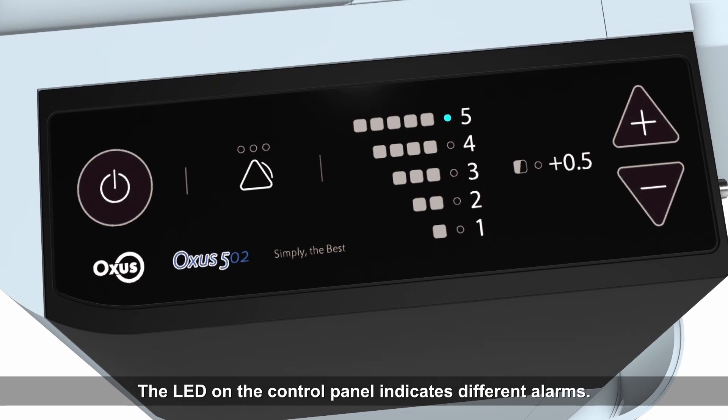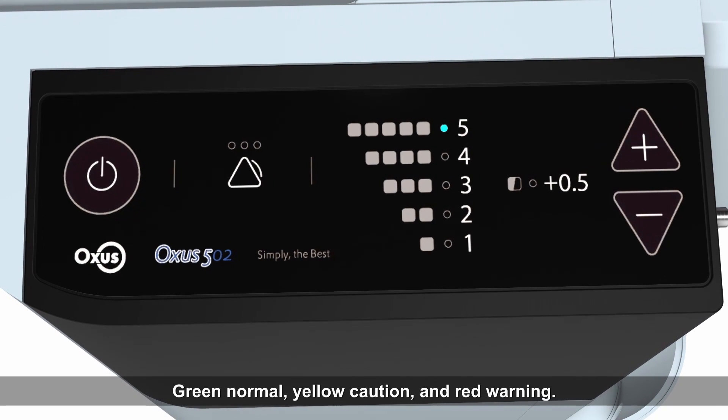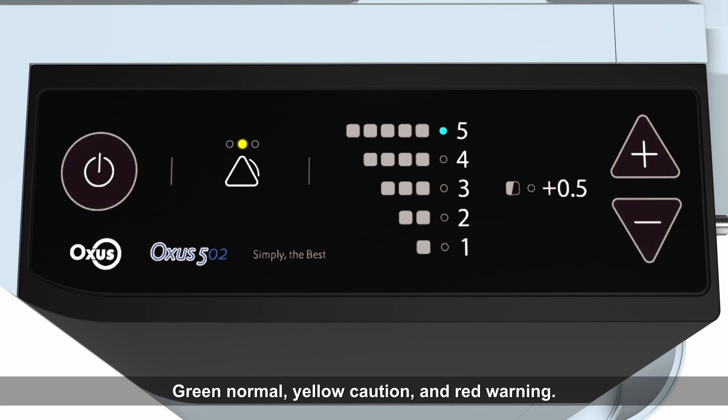The LED on the control panel indicates different alarms: green means normal, yellow means caution, and red means warning. If the oxygen purity is low, or there is a power outage, the LED color will change and the buzzer will alert.